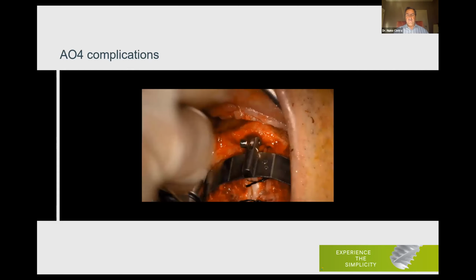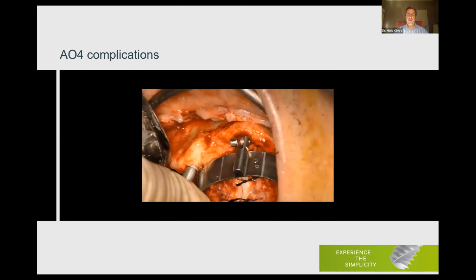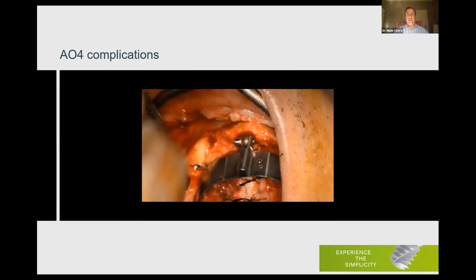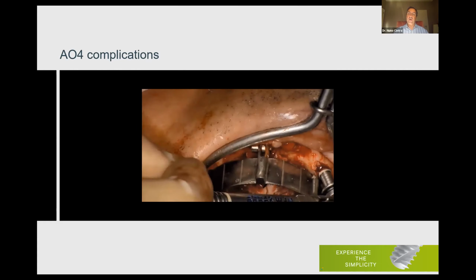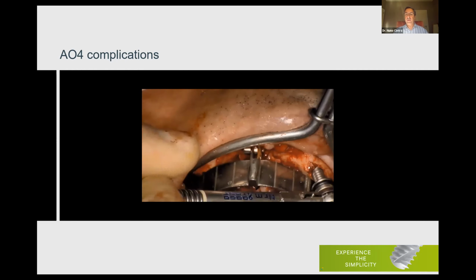Again, because they give me very good stability. As you can see here, I'm applying more than 50 newtons. As you can see, I'm using the guide to guide me in my 45 degrees. And again, these implants at the back, there was no problem because I have good thick bone, but in the front, again, these implants will work as osteotomes. These implants will make bone expansion. They will expand the bony walls.